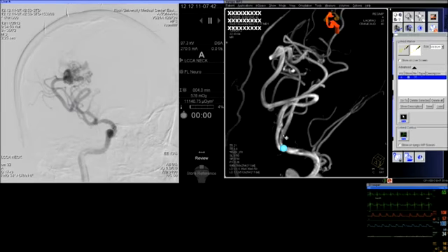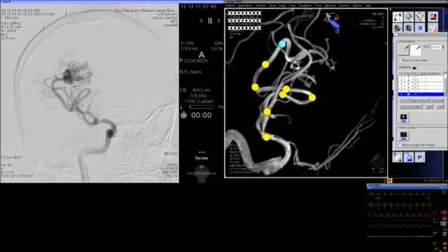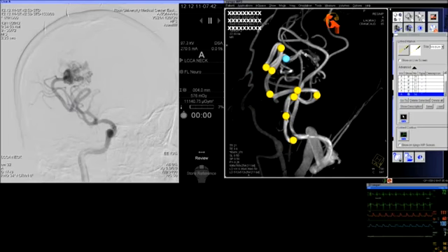We then decided to establish a pathway to the AVM, and I think this is very important because the morbidity of embolization a lot of times comes from access. So having mapping of your trajectory, so that you avoid having too many catheterizations of vessels in passage, is quite helpful.